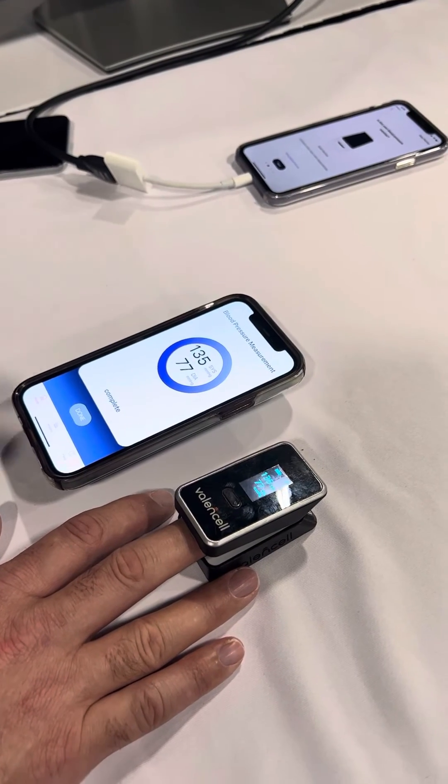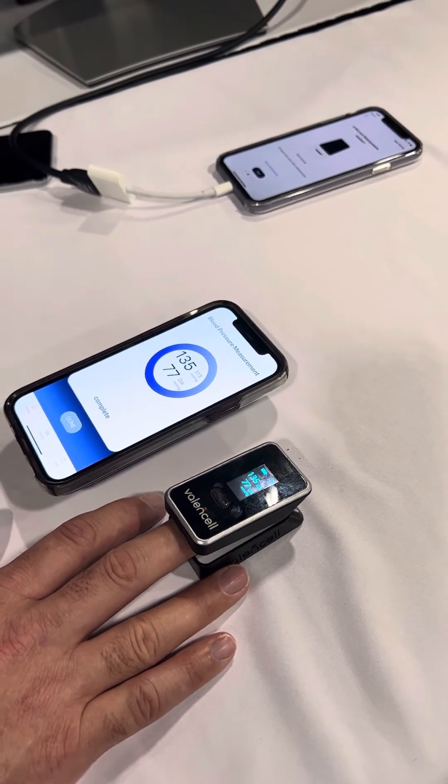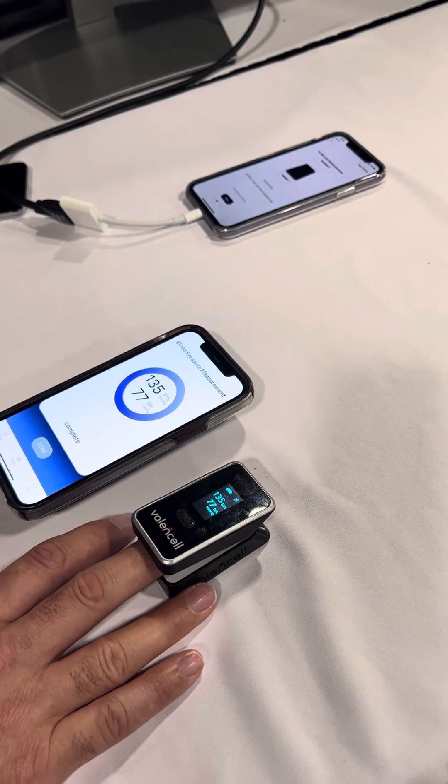The reality is your blood pressure is very dynamic. If you were doing continuous readings second by second, you would see that your blood pressure might swing by as many as 10 millimeters.